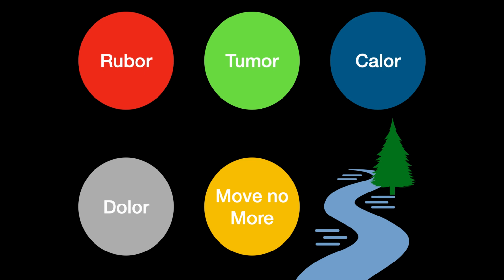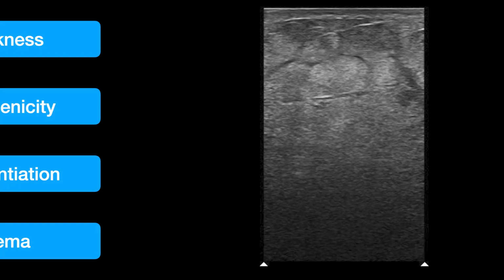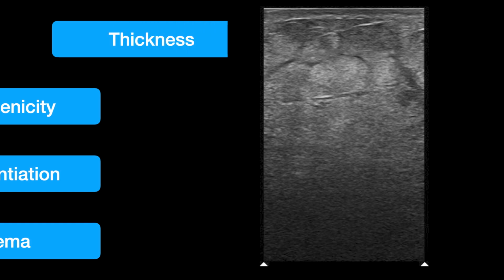What we can see, and we're going to show this here in just a sec, is as we move over the ultrasound image, we're going to see these different findings. I'll show you a slide just after we go through them that compares the normal versus the abnormal. We can really see the effects of that inflammation, of that infection, in the cellulitic patient on that ultrasound. So the first finding is going to be an increase in the thickness of the skin and subcutaneous layer.